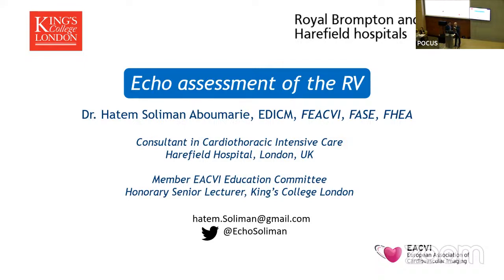Thank you. So thank you very much, Hatem. This is a difficult task because the right ventricle, first of all, is traditionally ignored, obsolete, but rather it's quite important for the cardiac function in general. Number 2, because of the anatomy and geometry, we cannot apply algorithms and models. We cannot apply the Simpson rule because of the shape. Actually, the right ventricle is 2 chambers.